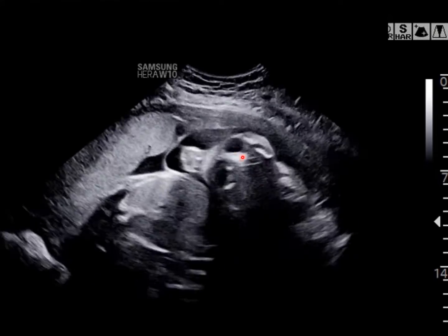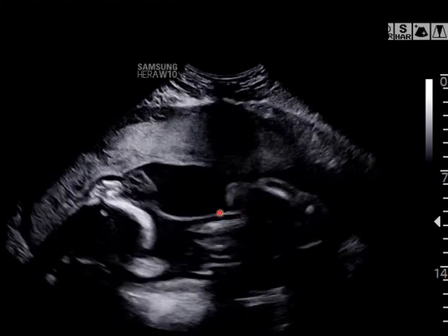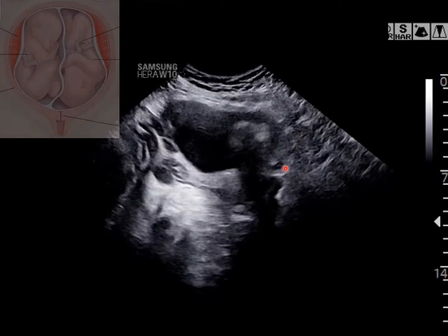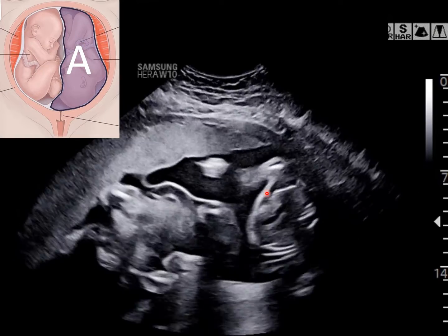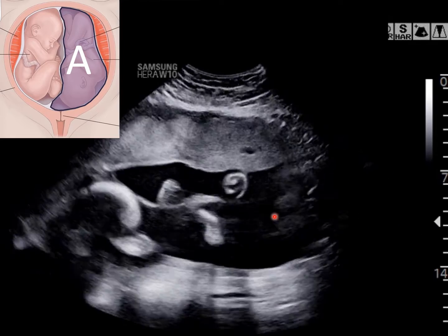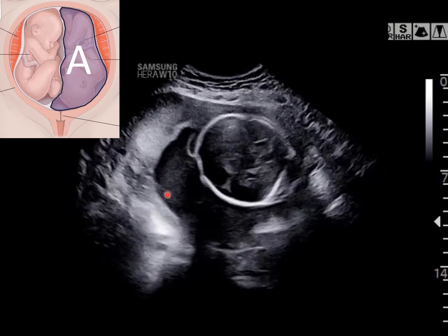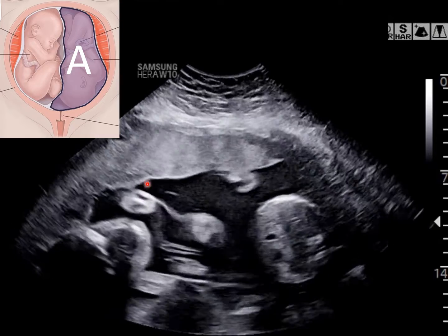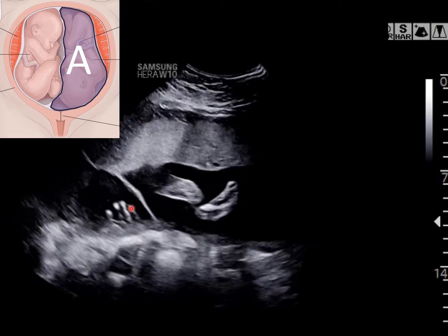First, you're starting in that transverse marker at maternal right side, and you're seeing through this sweep the fetus that's on the left side, maternal left side, is going to be A because the head shows up first. It's a cephalic presenting fetus. On the left, that is the first fetus that comes into view. And then on the maternal right, you can see that the second fetus, fetus B, shows up here as breech. And as you continue that sweep toward the fundus of the uterus, you see the head show up last.